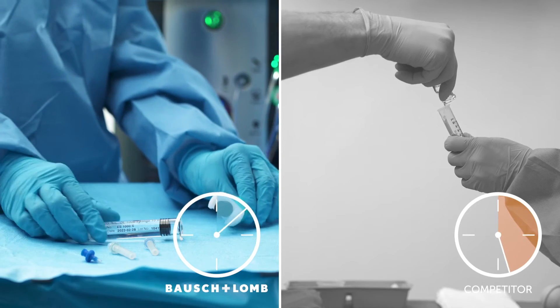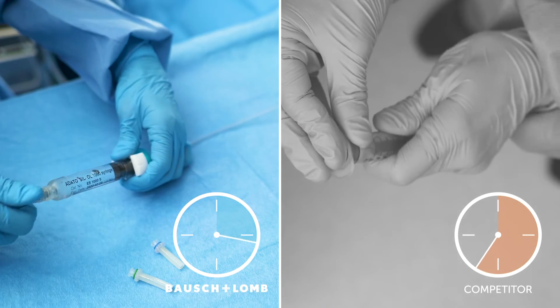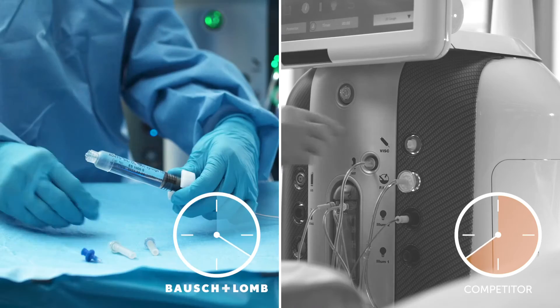Simply transfer the pre-filled sterile syringe from the package to the sterile field and follow the normal indications for use to connect to your vitrectomy platform.